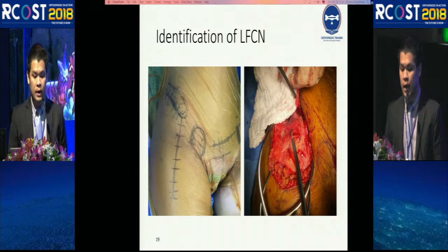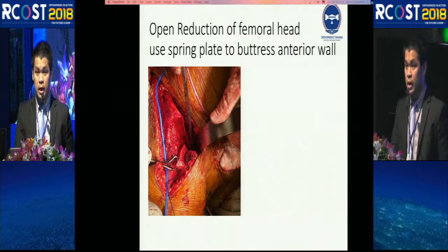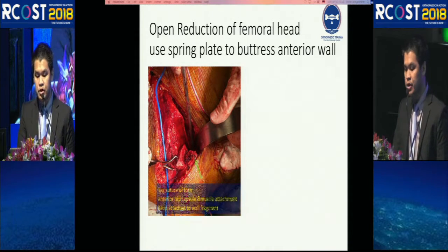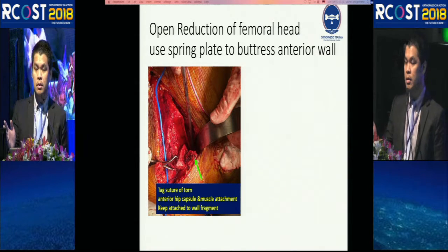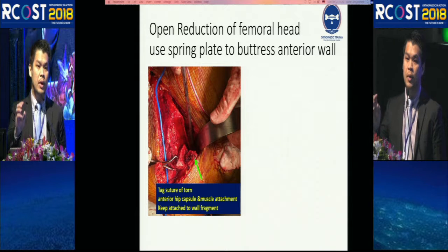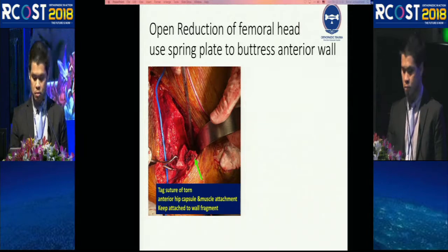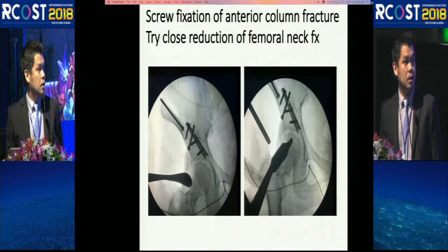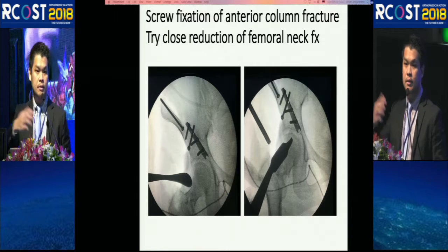Moving to the right side to fix the neck. I start with identification of the LFCN nerve. From the lateral approach extended to the Smith-Peterson, you can see the anterior column and anterior wall. I take a suture of the torn capsule but do not detach it from the anterior wall fragment because of avascular necrosis risk — important because the wall fragment is quite small. I then fix the anterior wall with a buttress plate and fix the anterior column with screws. I should mention I also pushed the femoral head back inside the joint.